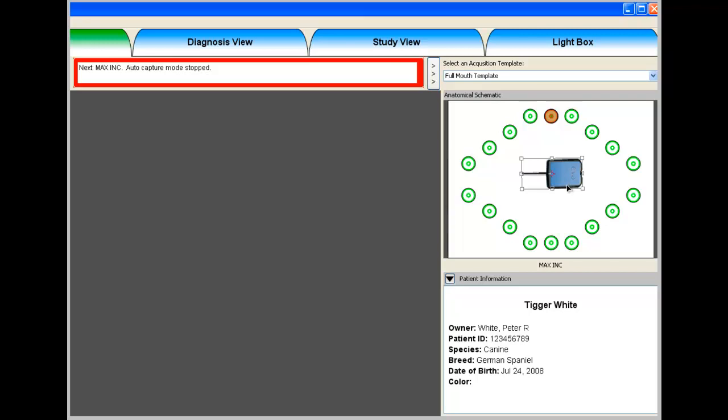That brings us to another topic, which is the right and left side. You notice that I just said we were on the left side of the animal when I had the sensor over here, which is actually to our right. And that's because in order for the orientations to remain correct, you have to think of these templates as being a mirror image, or in other words, we're facing the animal face to face, which means that everything on the left side of the chart or the template represents the right side of the dog or the cat, and everything on our right represents the left side.